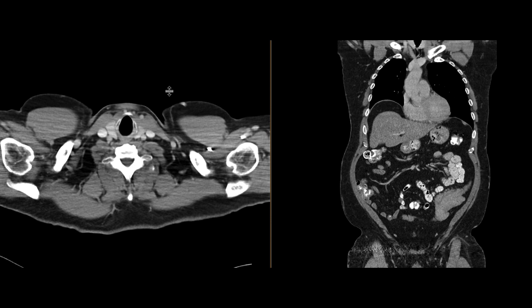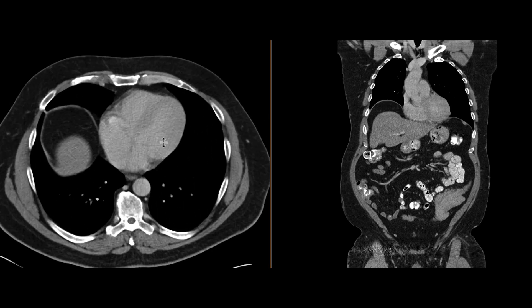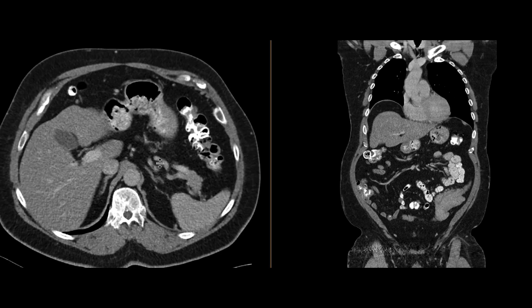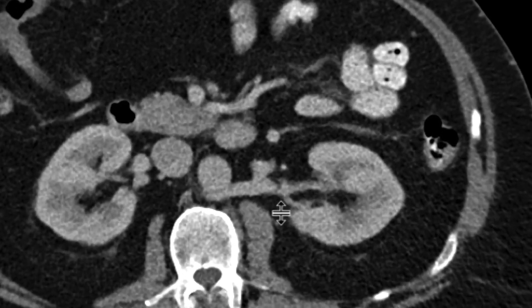This is a patient who had been having some abdominal pain as well as some constitutional symptoms of night sweats and weight loss. A chest and pelvis CT scan was obtained, done with intravenous contrast and some oral contrast as well.